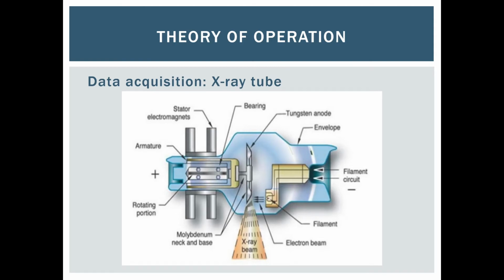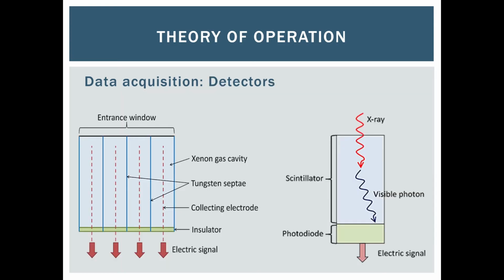The tungsten anode is placed on a rotating plate to be able to use two settings for the X-ray beam, either a larger area beam or a smaller area beam. That beam is then filtered through different filters to control the size and the amount of dosage per patient, and so on.